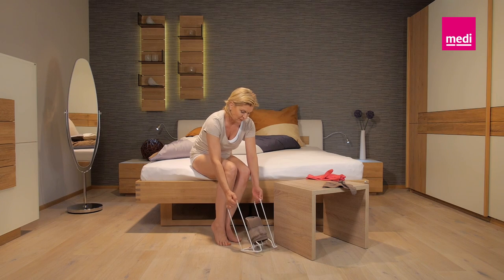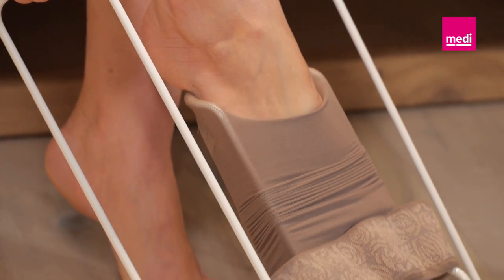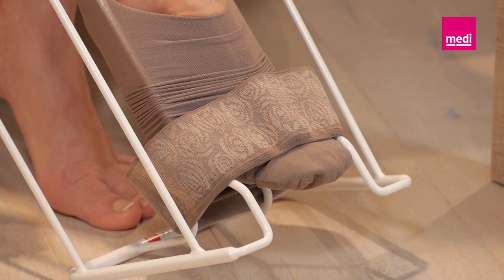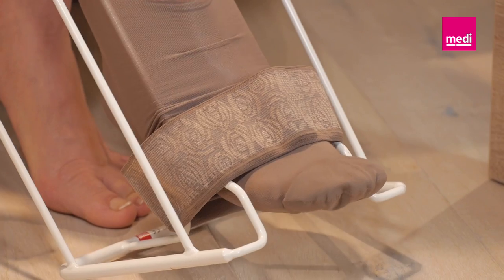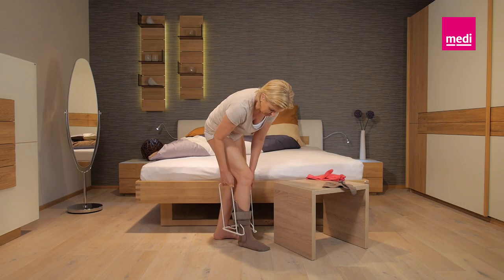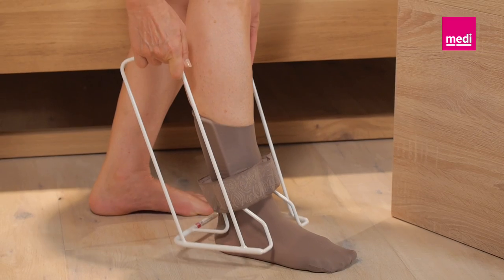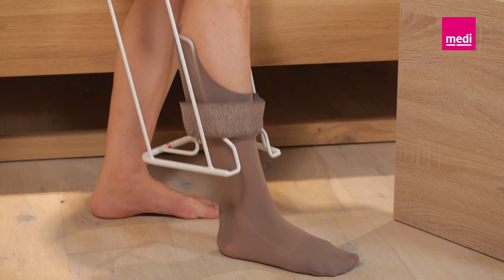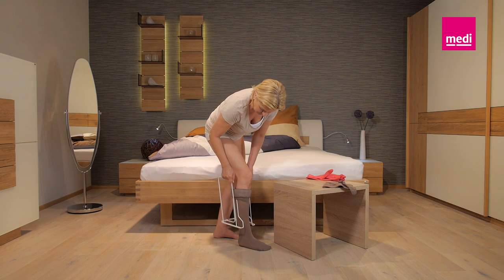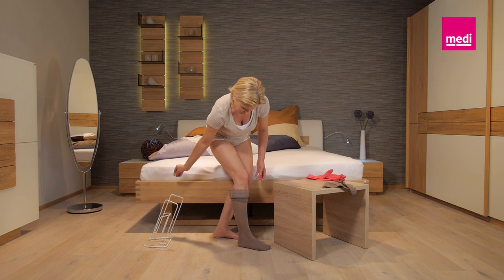Place the Medi-Butler on the floor in front of you. Hold the side handles and tip the butler backwards so that you can slip your foot easily into the stocking. Hold the butler firmly by the handles and slide your toes slowly into the stocking. Once your whole foot is in the stocking, you can put your foot down on the floor and stand up. Now, pull the Medi-Butler up towards your knee and pull the stocking up your leg by pulling and pushing alternately on both handles.